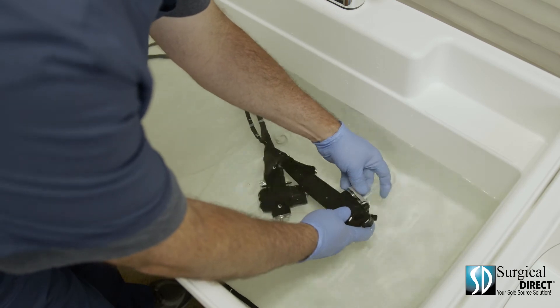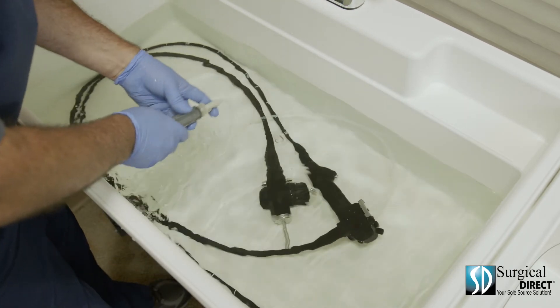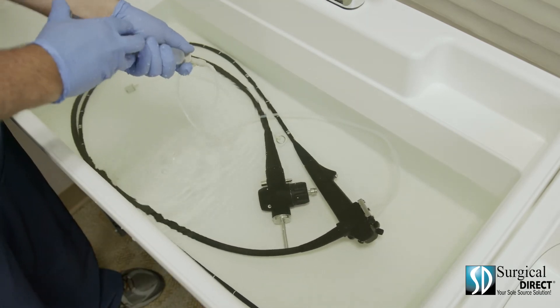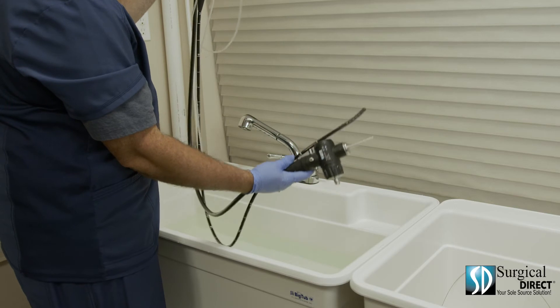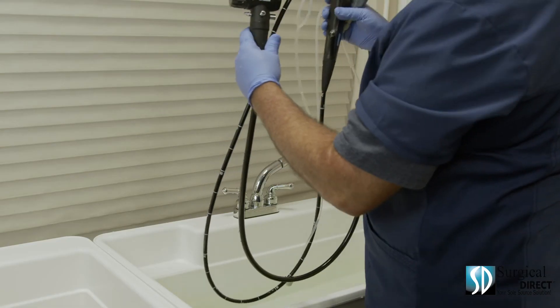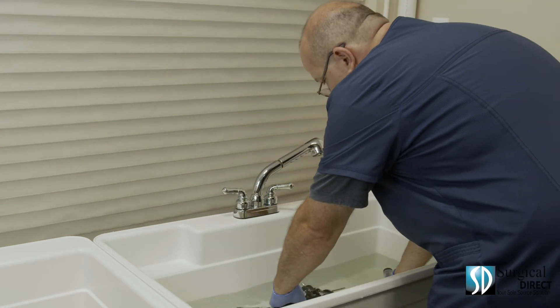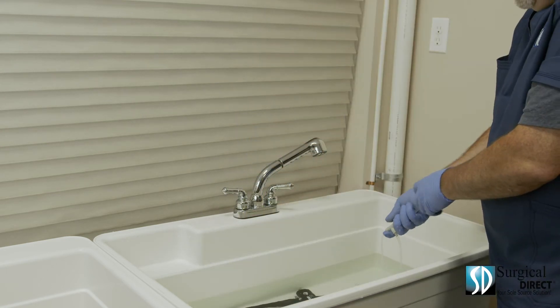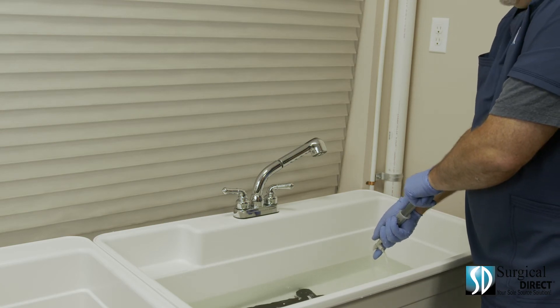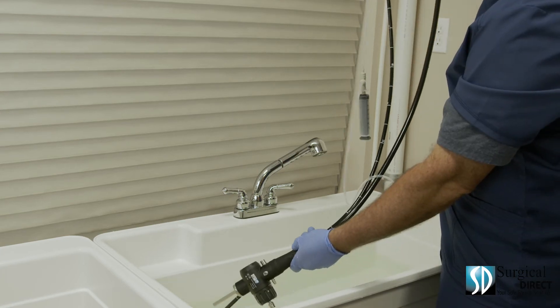Reattach the cleaning tubing to the scope and be sure that it's attached firmly. Using a 30cc syringe, flush the detergent through the scope. Remove the scope from the cleaning solution and allow it to drain. Place the scope in a second tub filled with clean water. Use the tubing to completely flush all enzymatic cleaner from the scope, flushing fresh water for three minutes. Remove the scope from the clean water.